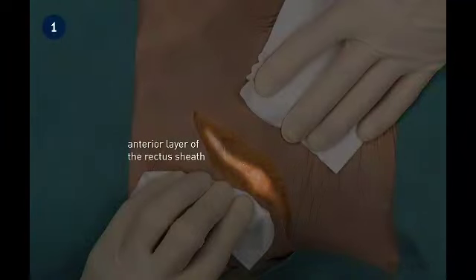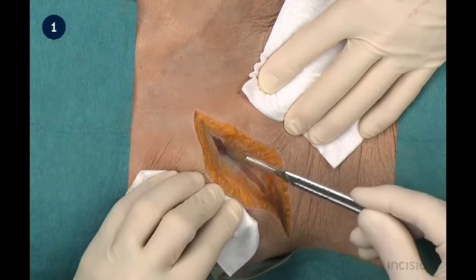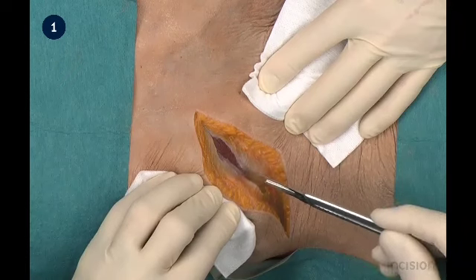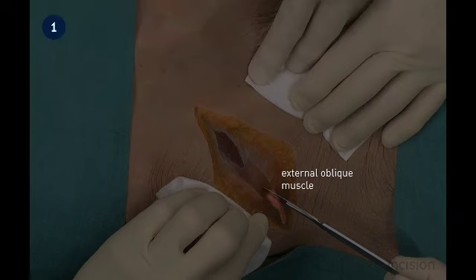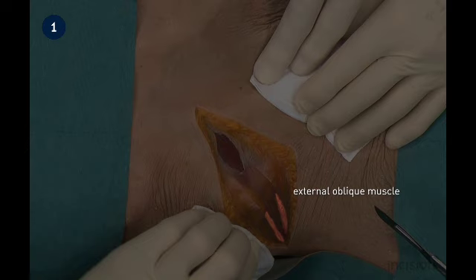Take note of the anterior layer of the rectus sheath that is now incised. When incising the anterior layer of the rectus sheath, care is taken to keep a distance of at least 2.5 centimeters from the costal arch to prevent difficulties due to tension when closing later on. The external oblique muscle is now highlighted and transected. Take note of the transected ends of the external oblique muscle.